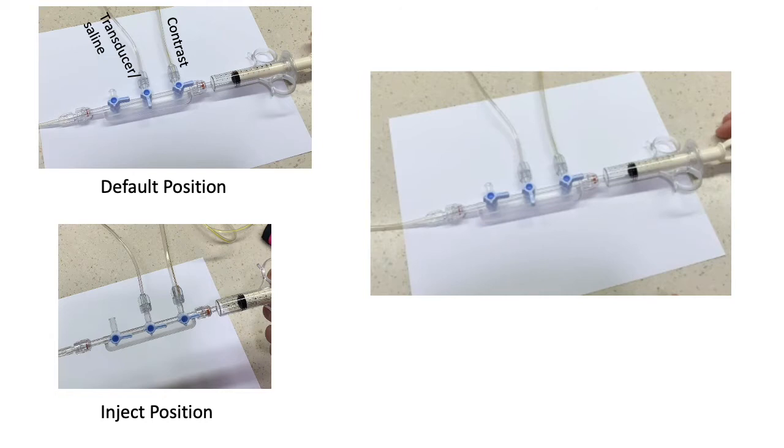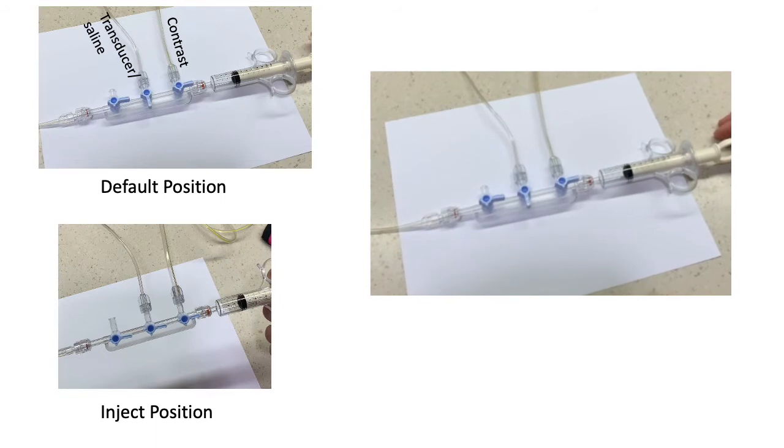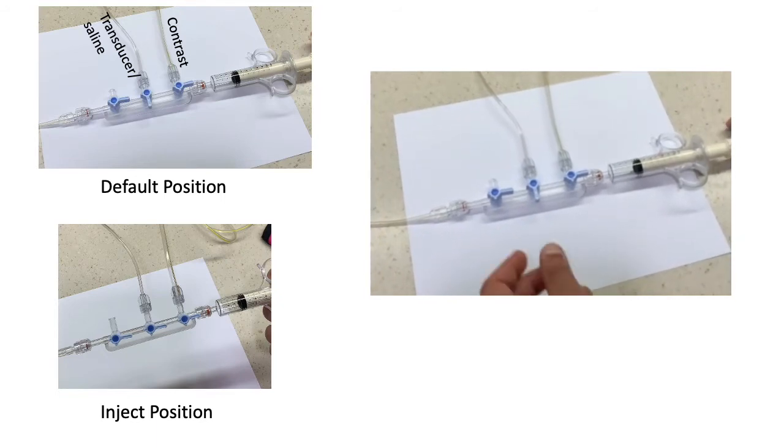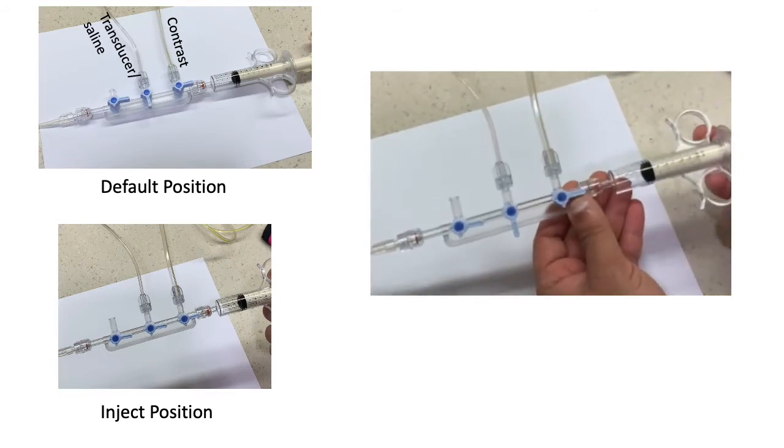The top left is the default position with the middle valve pointing down. This default position allows us to measure pressures.